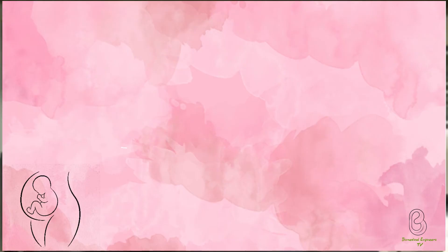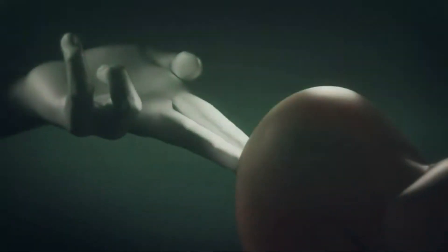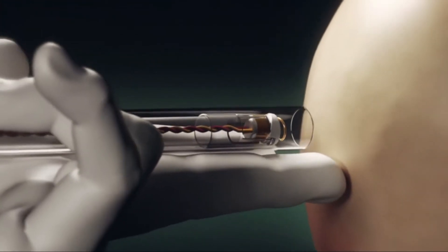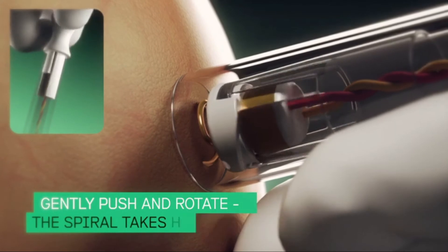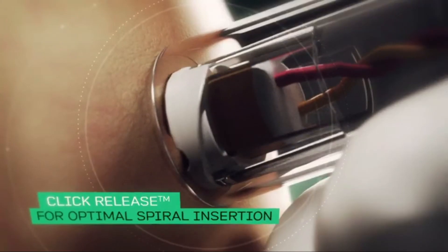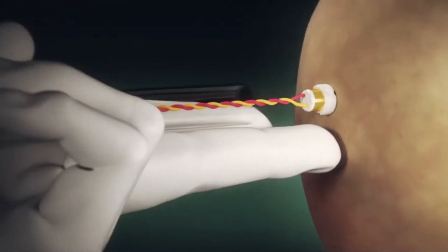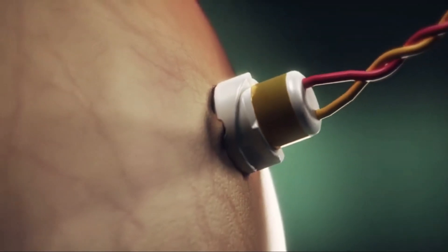The next transducer is the spiral electrode, also known as the fetal scalp electrode. Internal Cardiotocography uses an electronic transducer connected directly to the fetal scalp. A wire electrode is attached to the fetal scalp through the cervical opening and connected to the monitor. Internal monitoring provides a more accurate and consistent transmission of the fetal heart rate than external monitoring because factors such as movement do not affect it. Internal monitoring may be used when external monitoring is inadequate or closer surveillance is needed.